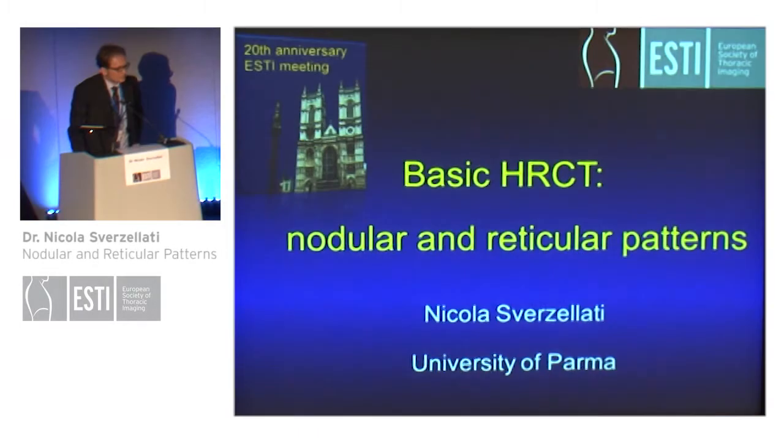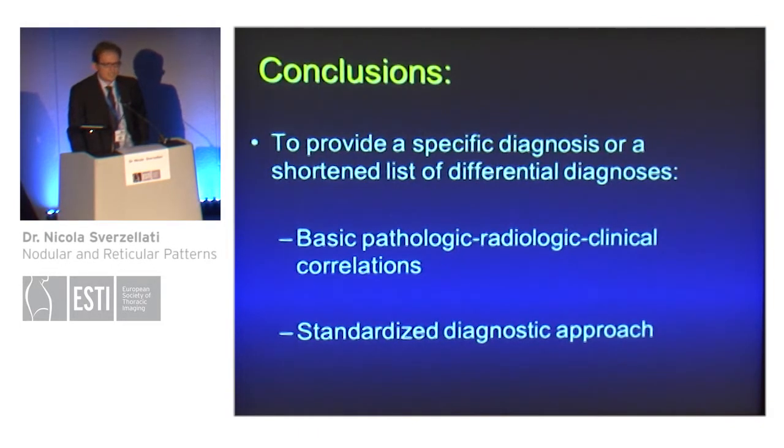I'm going to talk about the nodular and the reticular patterns. Let's start my presentation from the conclusions. As for all diffuse lung diseases, our task is to provide a specific diagnosis when possible, or more frequently, a shortened list of differential diagnoses.